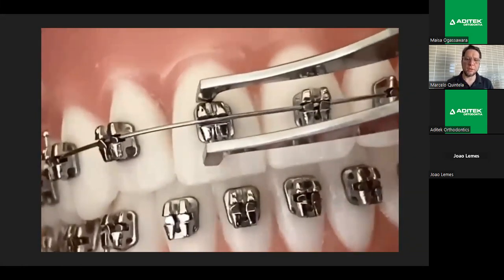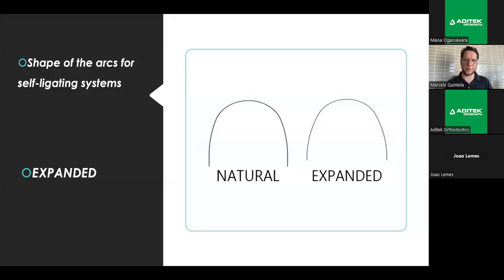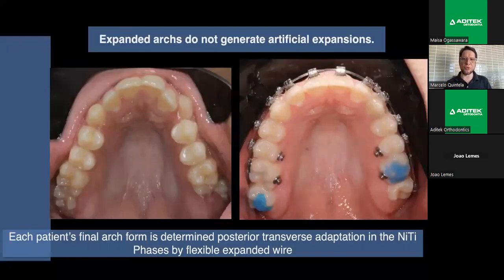And you needed something easy to do that. Well, we put together brackets and arcs, 4 pairs of arcs. The shape of the arcs for the self-ligation system is not natural, it's always expanded like this. And expanded arcs do not generate artificial expansion, remember that. Each patient's final arch form is determined by posterior transverse adaptation in the nickel titanium phases by flexible expanded wire.